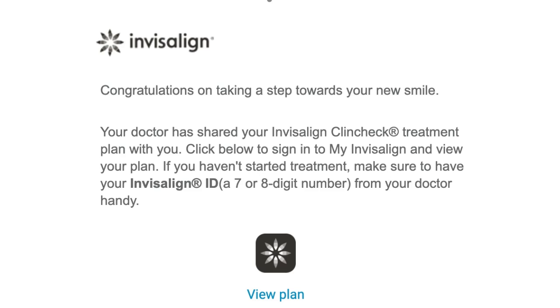Once you do that, they're going to ask for the patient's information and the patient's parents' email, and they're going to give you a big disclaimer. Fine, you do it. There used to be a PIN code. They would send the parent two emails, one with a link and one with a PIN code. It was super easy, but they just stopped doing this, and now the patient actually has to register, which I hate that idea, because not everyone wants to register as a patient and give their contact information to Align Technology. Now it's the only way you can access that information as a consumer, and I think it's very frustrating.